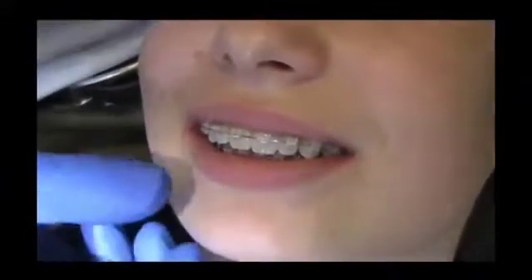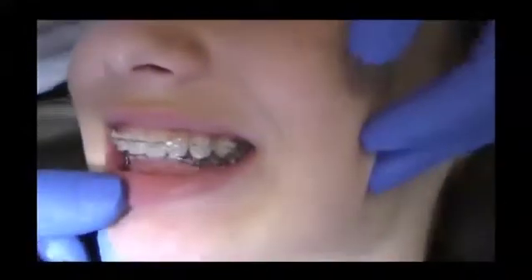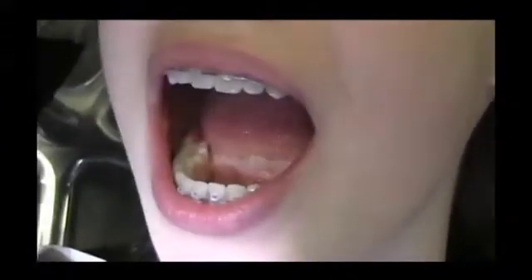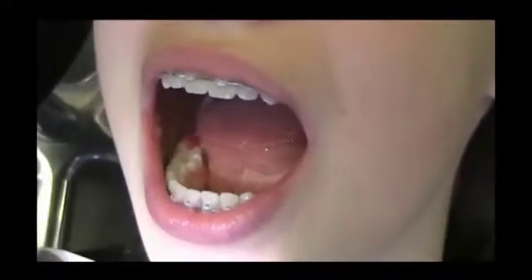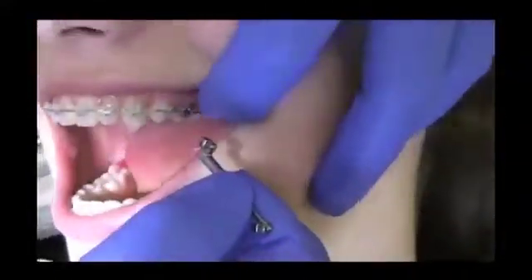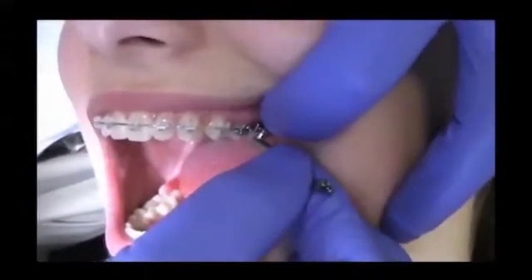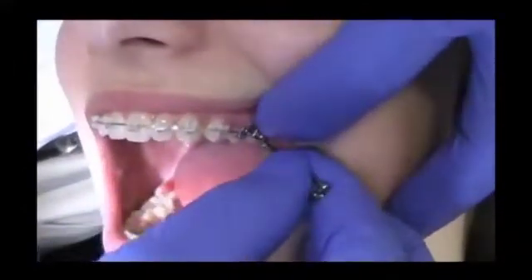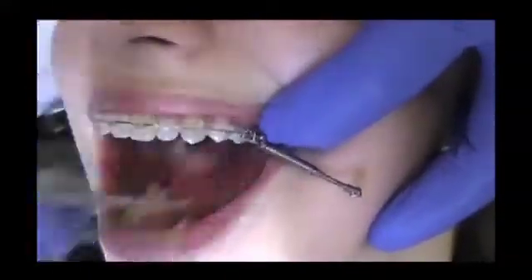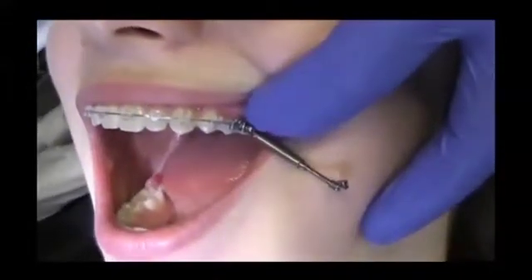The following video sequence is uncut and in real time. We begin with the fixation of the left side. First, the Biobite corrector is fixed in the upper jaw. Slide the screw body on the arch wire from gingival to occlusal. Then you can attach the screw using the screwdriver.